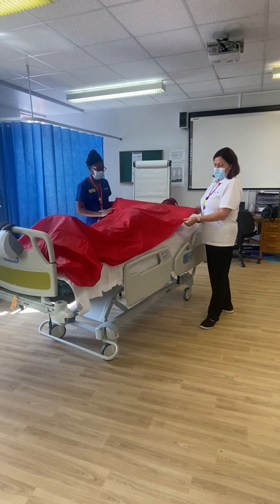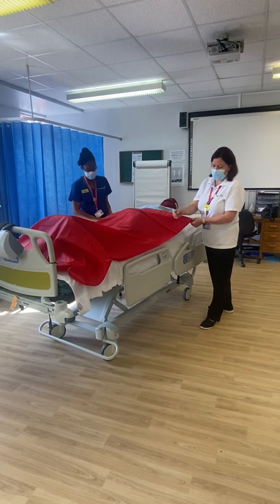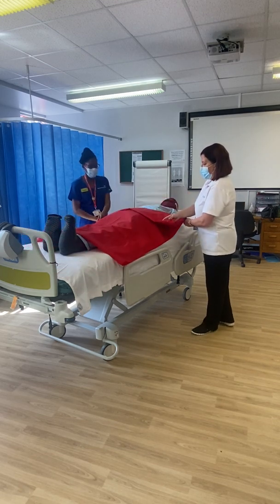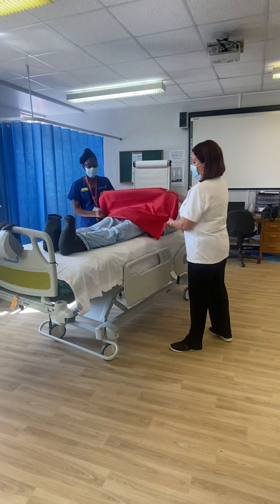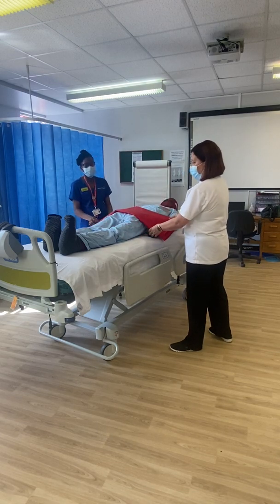And then what we're going to do is that we're going to make a fold in the slide sheet, like that, pull it slightly towards us, and then keep folding the slide sheet all the way down to the bottom. And then when we get to the bottom, we're going to turn the slide sheet completely over.